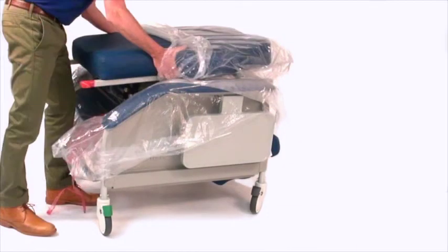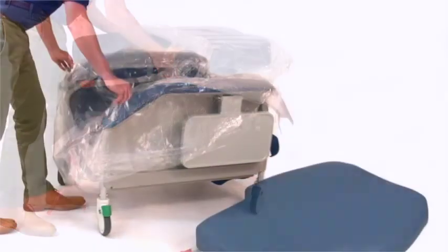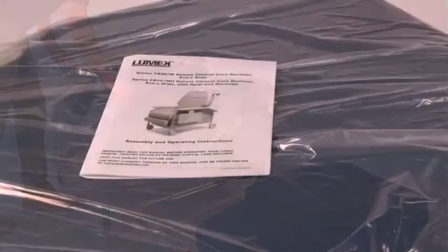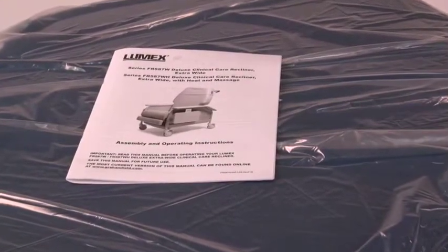Remove the recliner back and set aside. Remove all packaging from the recliner back and review the assembly and operating manual. Keep for future reference.